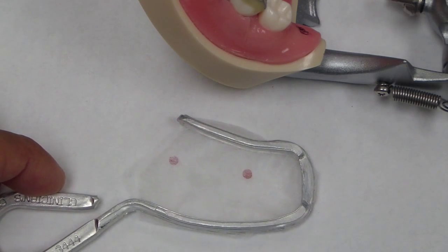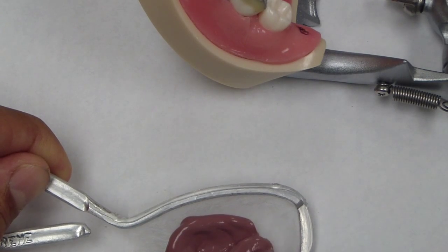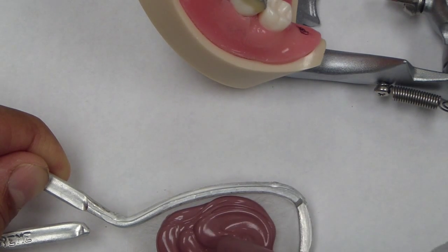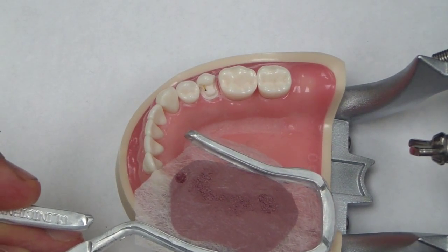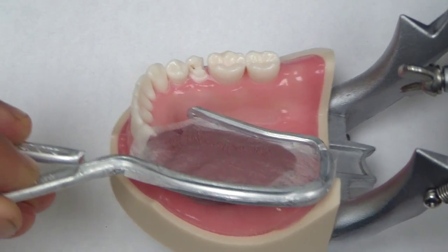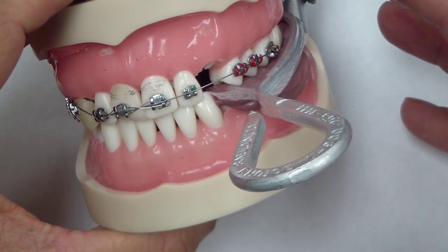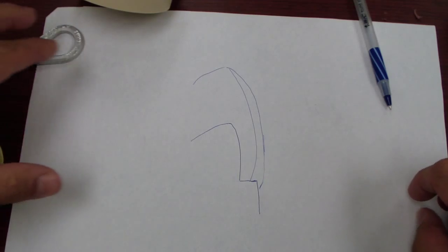We're going to create a stent with this tray. You don't see any adhesive on here — that would probably be a good idea — however this is just for a stent. We're going to place it intraorally onto our tooth and let that set. Now we're creating our stent, and the next step will be preparing the tooth.